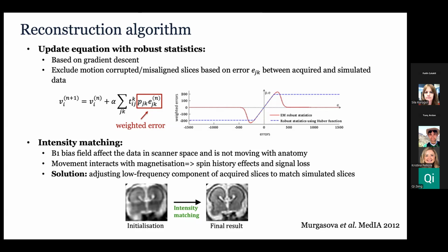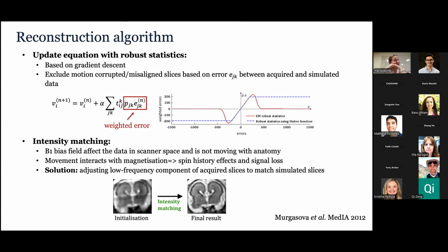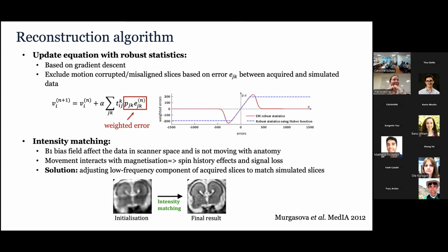Yeah, I think we had some very bad cases in 3T as well with this. I sometimes see a radiologist calling an abnormality because of this, right? Because if the B1 field is such that left and right, one is dark and one is bright, sometimes they will say, oh, there's a signal intensity change on the left, and it might be a fellow or something. But if you see that, let me know because I should correct them. Yeah, and educate them.